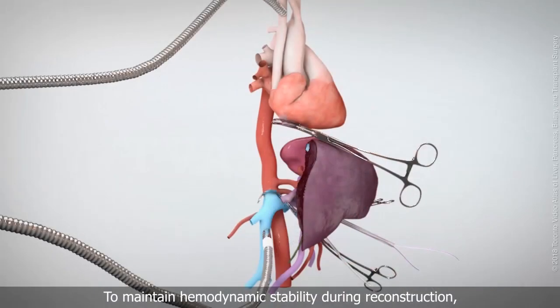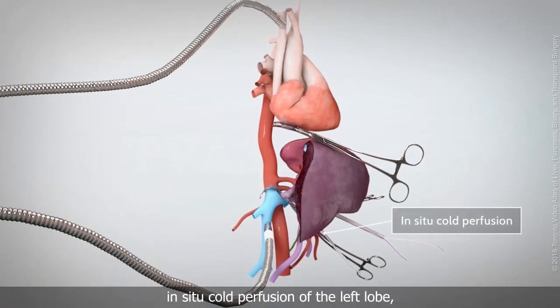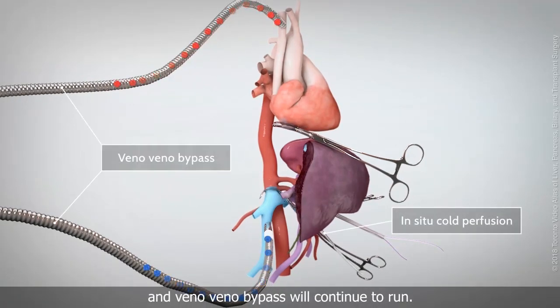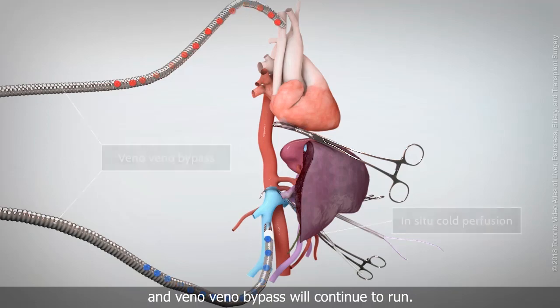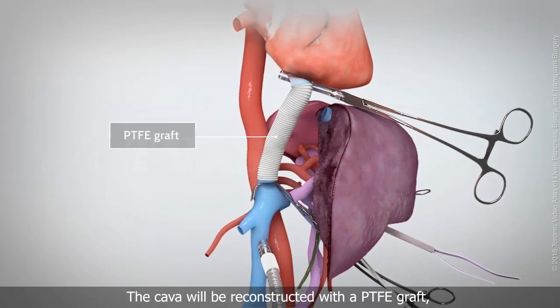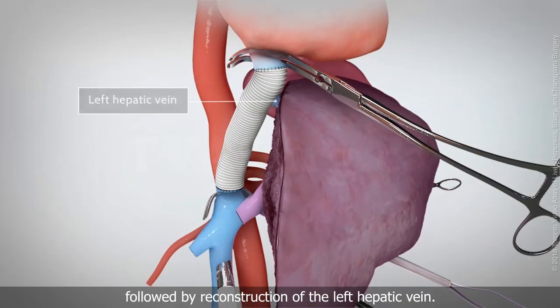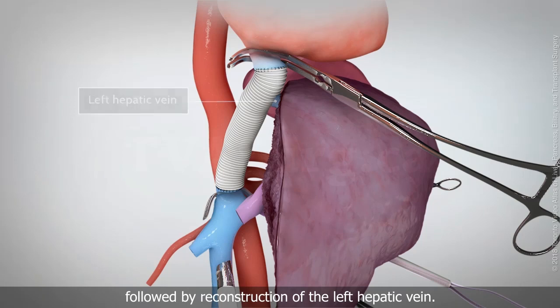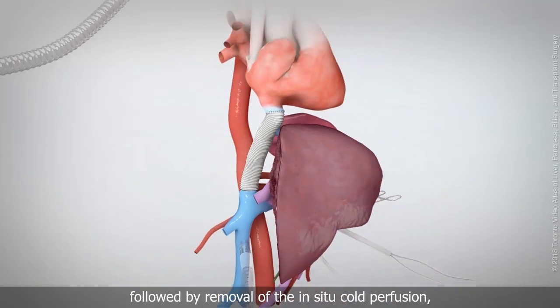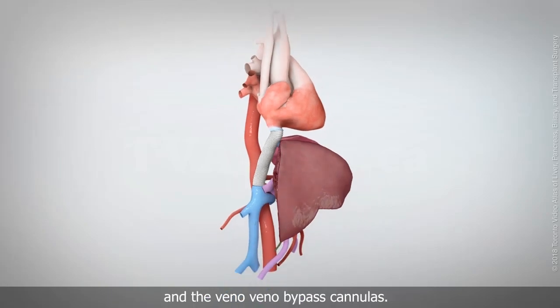To maintain hemodynamic stability during reconstruction, in-situ cold perfusion of the left lobe and veno-veno bypass will continue to run. The cava will be reconstructed with a PTFE graft, followed by reconstruction of the left hepatic vein. Cava clamps will then be removed, followed by removal of the in-situ cold perfusion and the veno-veno bypass.